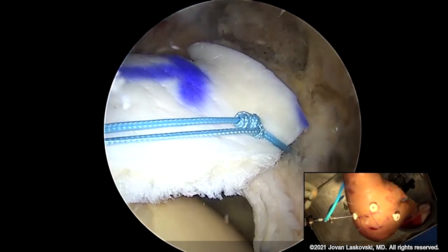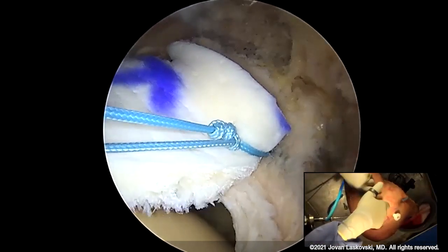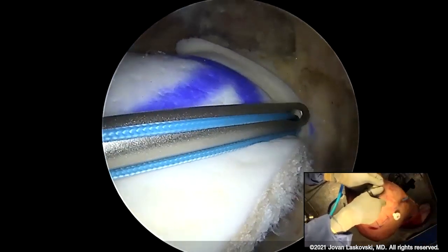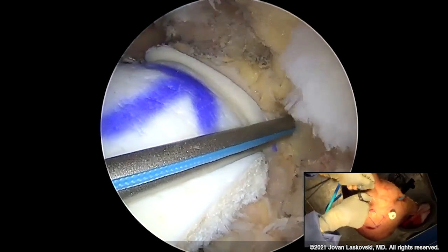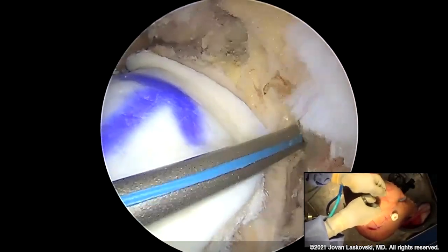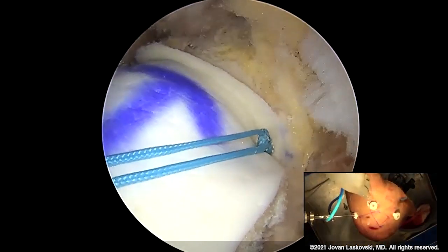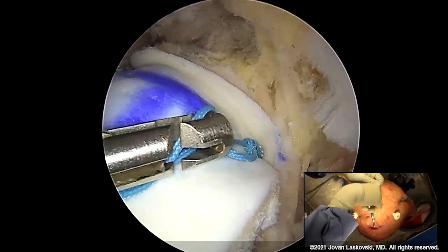I want a good ingrowth surface because I don't want this failing on the glenoid side. What I like to do is leave that glenoid intact to get as much stability as we can — basically canceling out superior migration. Then once I tie my last knot — an SMC followed by reverse alternating half hitches and alternating posts — we'll cut it. Then I'll zoom out and show you how we've now turned this into a rotator cuff tear repair.